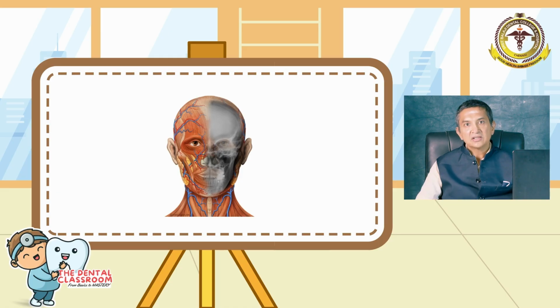As I mentioned, cephalometrics comes from the word ceph, which means head, and metrics, which means measurement. So in simple terms, it is a study of the head measurements, and it should be emphasized that it is a supplemental diagnostic aid and is not meant to replace a clinical examination. The clinical examination is critical and is an essential diagnostic aid, and the cephalometric parameter is just used to substantiate, just used to prove what is assumed or diagnosed at a clinical chairside level.